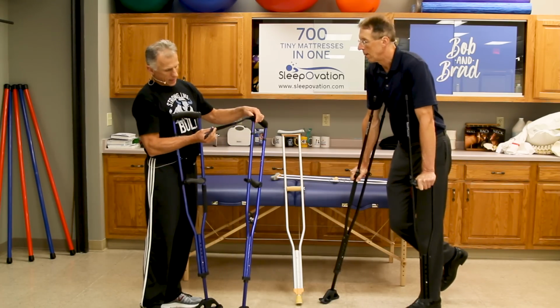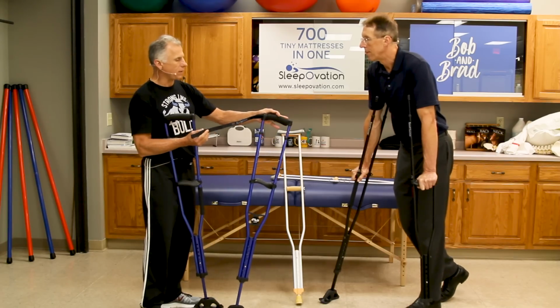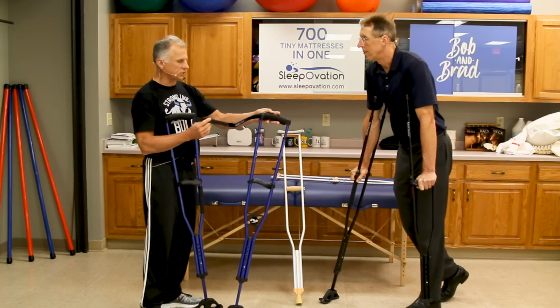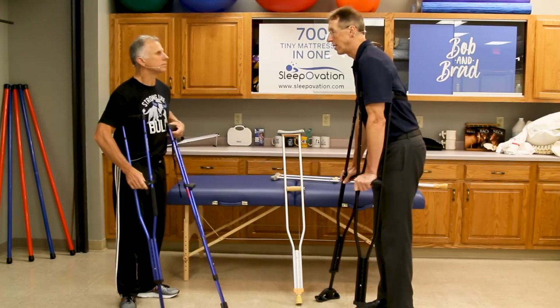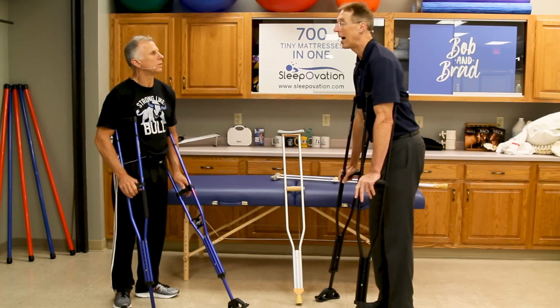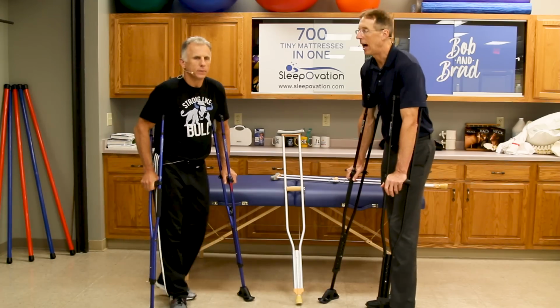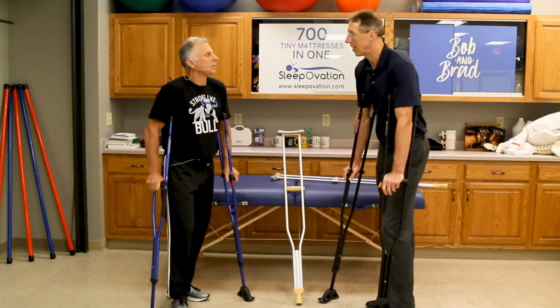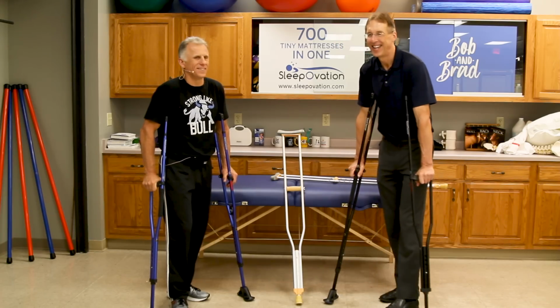And you can see mine, I have it disconnected now, and we were talking that this is probably for just using the crutches for short distances. I would not use the link for short distances around the house. I would use it like if you're in the mall or something like that. Kids still go to the mall? I don't even know if malls exist anymore. But if they do.